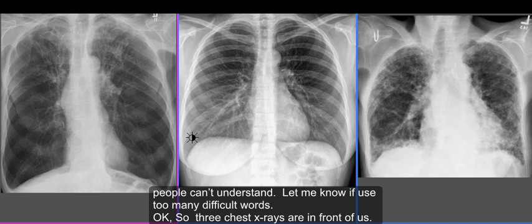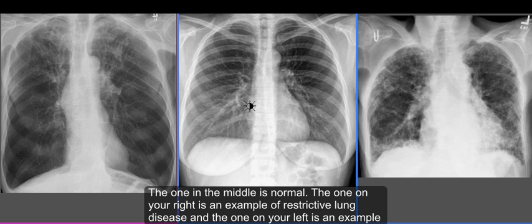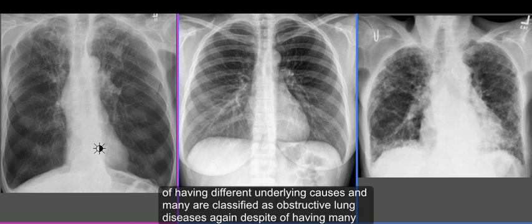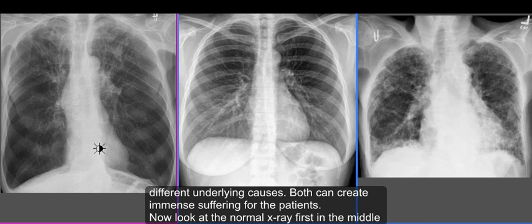Three chest X-rays are in front of us. The one in the middle is normal, the one on your right hand side is an example of restrictive lung disease, and the one on your left is an example of obstructive lung disease. Under a wider umbrella, many lung conditions are classified as either obstructive or restrictive lung diseases, despite having different underlying causes, and both can create immense suffering for patients.